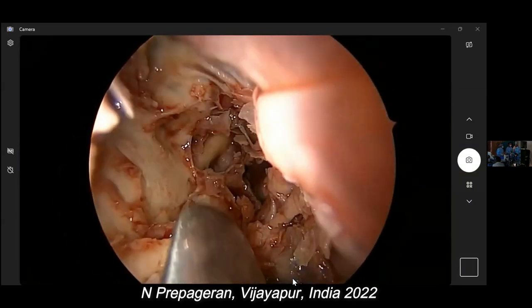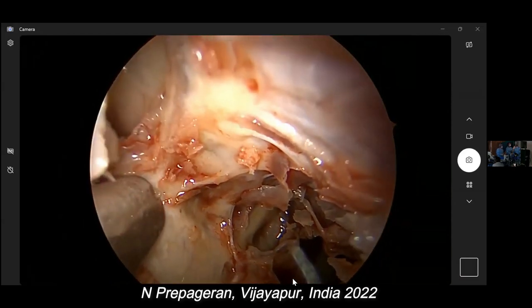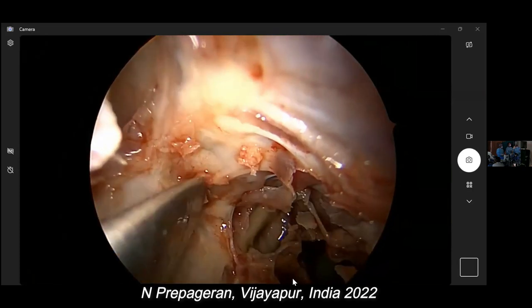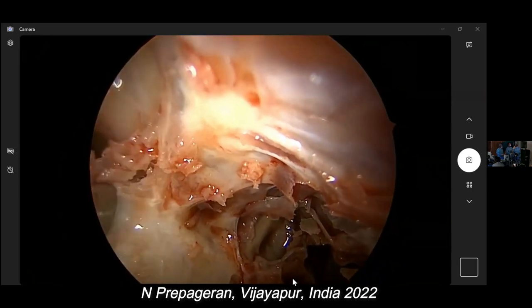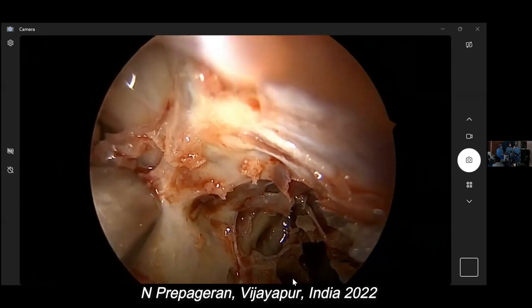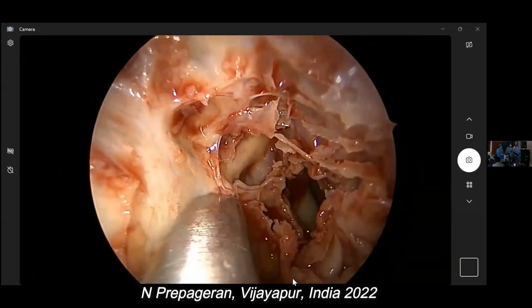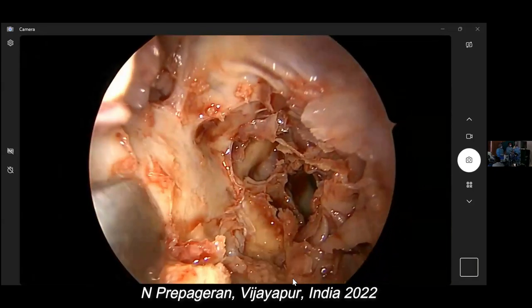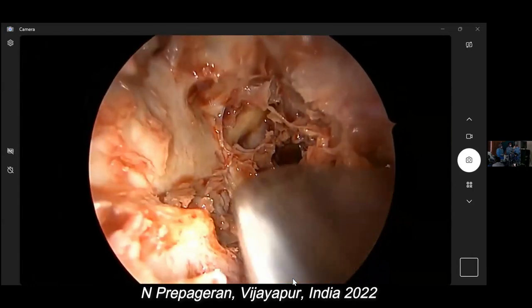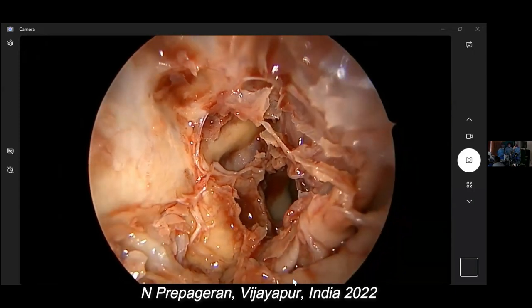So here, you can see how I'm dissecting the middle ethmoidal vessel. And yes, that is the anterior ethmoidal artery. See whether I can connect. There, that's your artery. Got it? The same way now, I'm going to dissect the orbit. That's the orbit being dissected away. Okay. So the same way now. Can I have a curette?